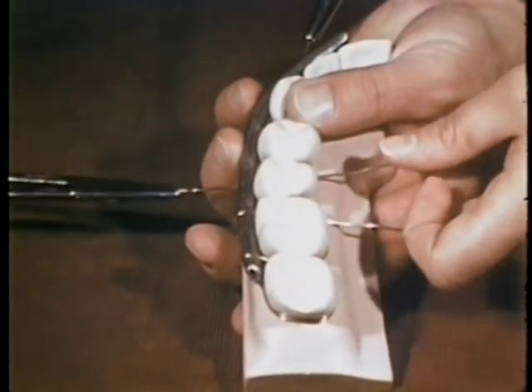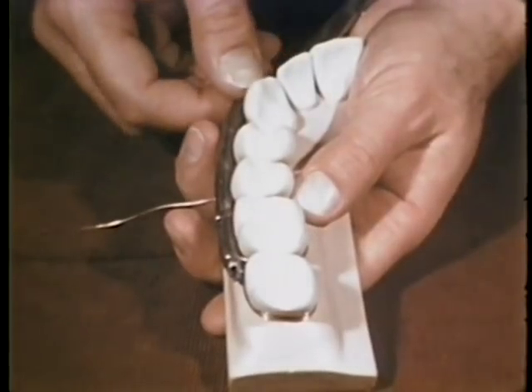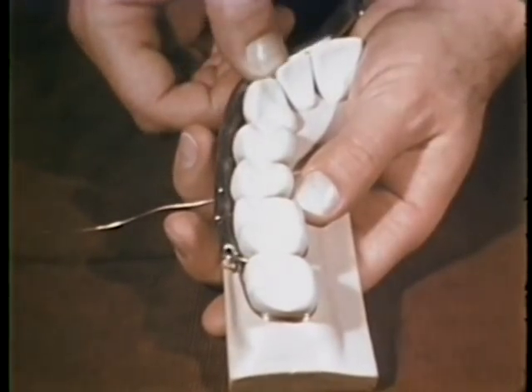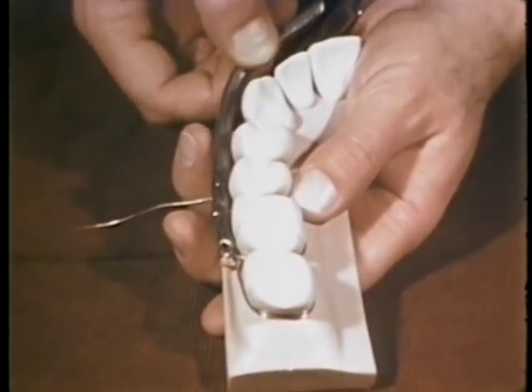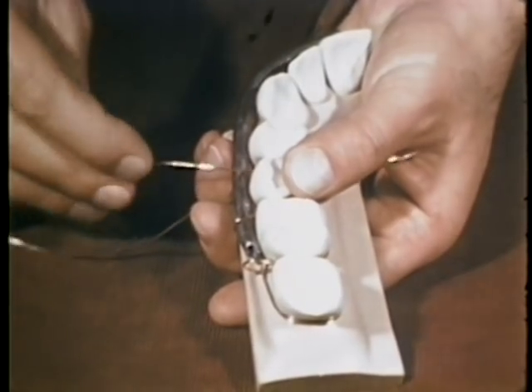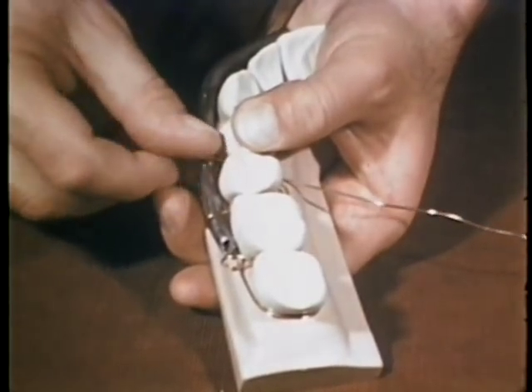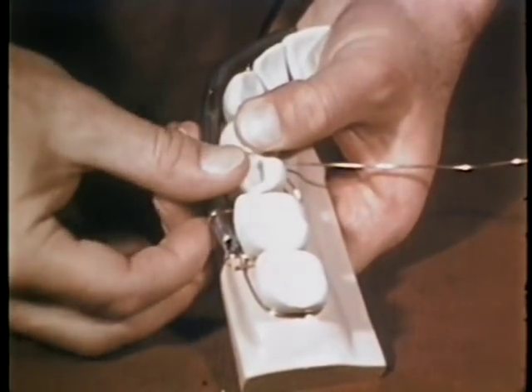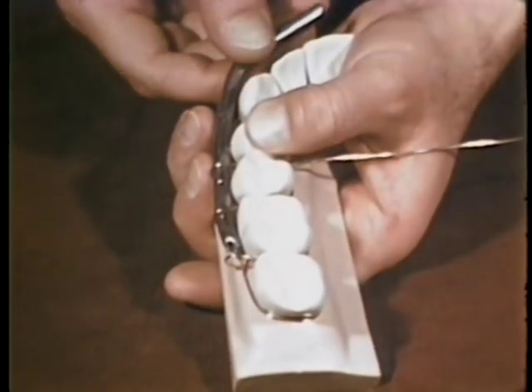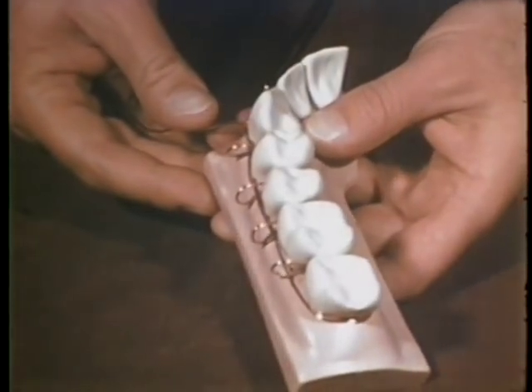The wire should be grasped by its end to prevent later breakage from nicks and bends. Following the original wiring technique, the solder is withdrawn from the first loop formed before the third one is completed. Thus the solder is left in only two loops at a time, and its removal in one piece is easier. All loops are uniform and the solder is removed.